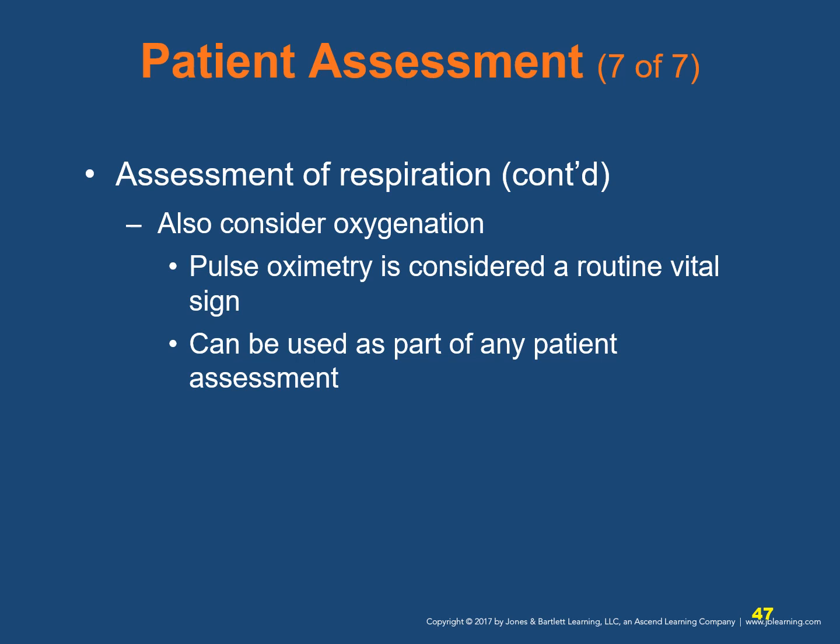Factors that can cause inaccurate pulse oximetry readings are hypovolemia, severe peripheral vasoconstriction from chronic hypoxia, smoking, or hypothermia, a time delay in detecting respiratory insufficiency, dark or metallic nail polish, dirty fingers, or carbon monoxide poisoning. Pulse oximeters do not replace a complete assessment. Pulse oximetry cannot measure the effectiveness of ventilation or provide information about total cellular metabolism. To assess ventilation, you will need to measure end-tidal carbon dioxide levels. End-tidal CO2 is measured by capnometry and capnography devices.